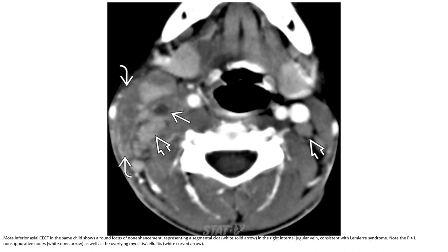More inferior axial contrast-enhanced CT in the same patient shows a round focus of non-enhancing material representing a thrombus within the right internal jugular vein, consistent with Lemierre syndrome. Note also the right-sided suppurative node and overlying myositis and cellulitis.